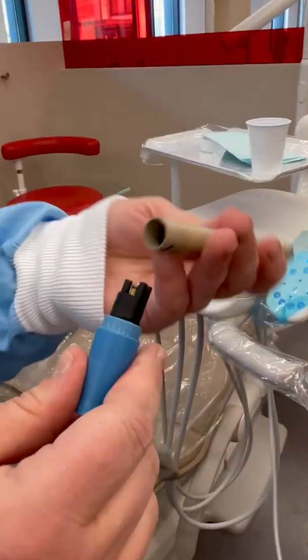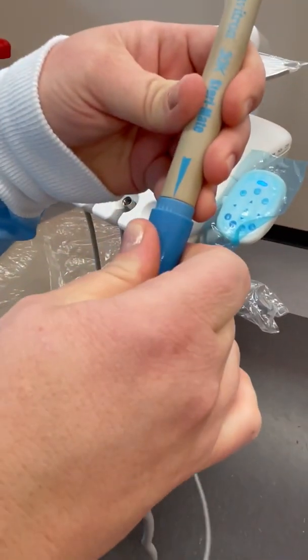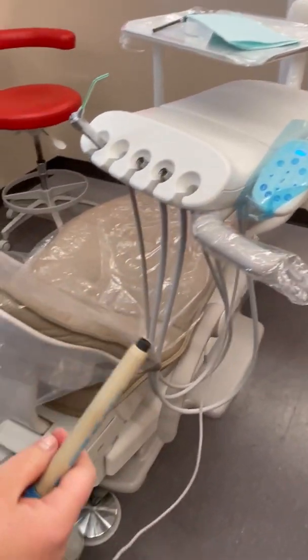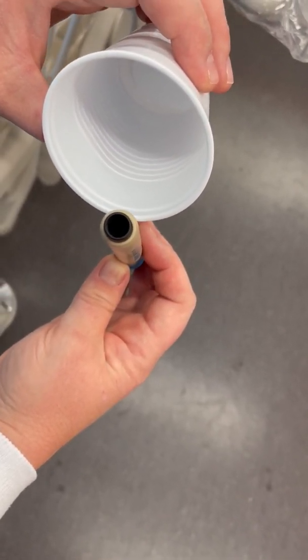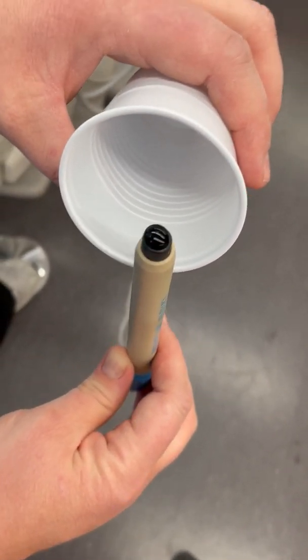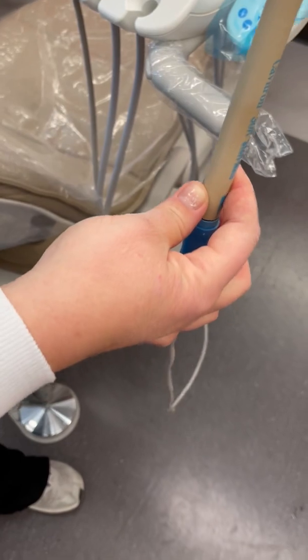Your handpiece — turn the water almost all the way down, just a little bit up. Then make sure your foot pedal is on water. Step on it until the water comes to the top. Turn it up a little bit.